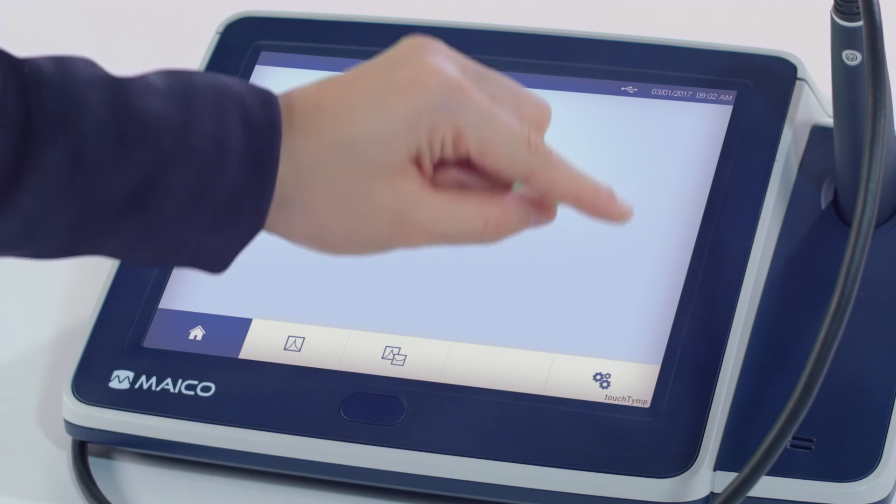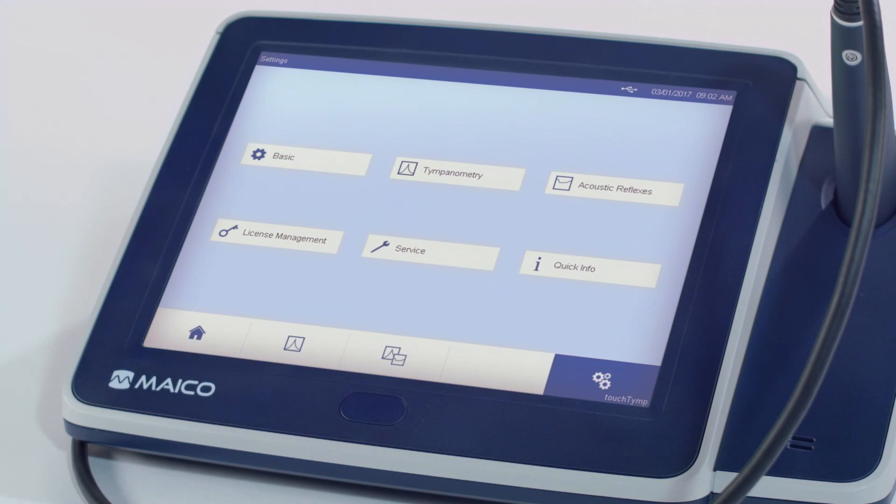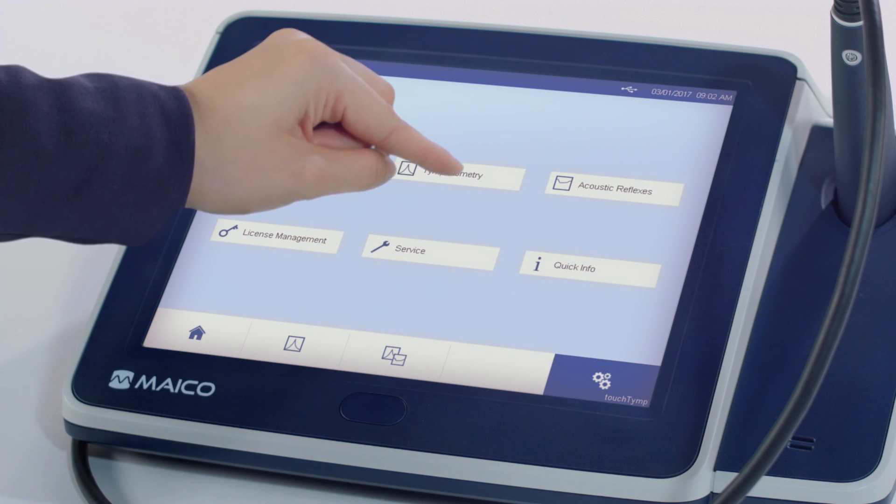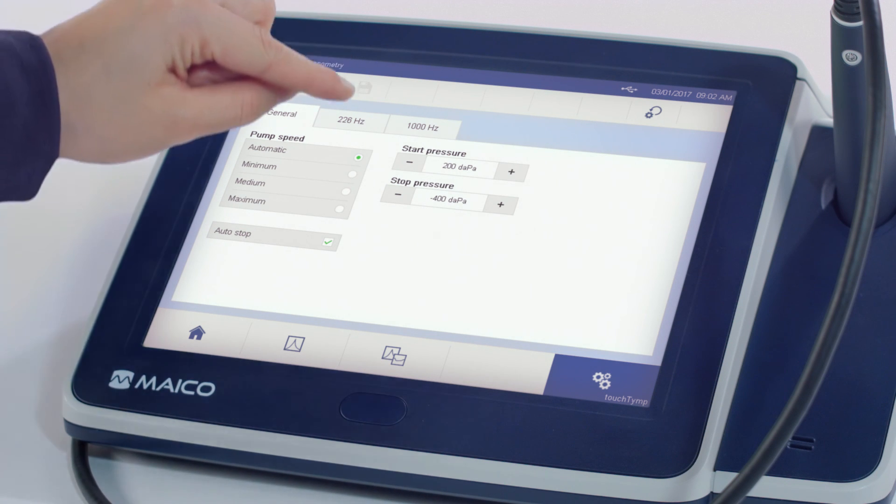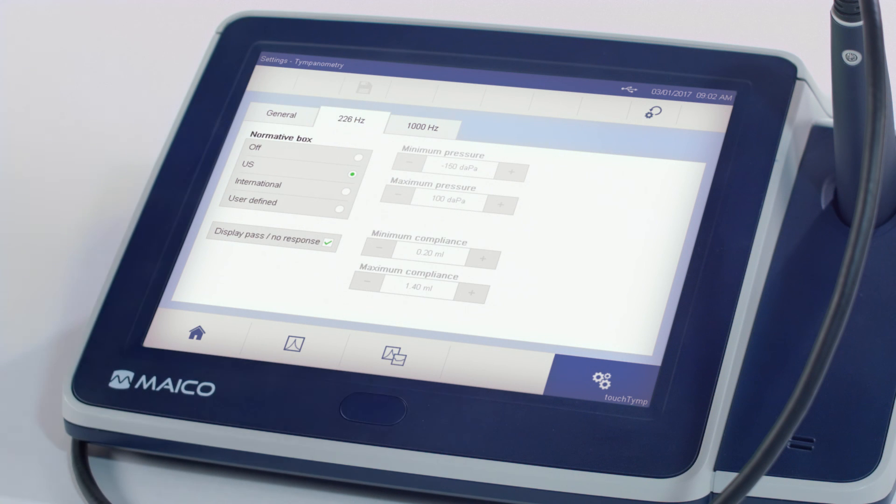The touchTymp has a variety of custom settings to modify the standard protocols within the device. Some examples include displaying a normative box for the tympanometry results or a pass, no response indicator upon completion of the test.